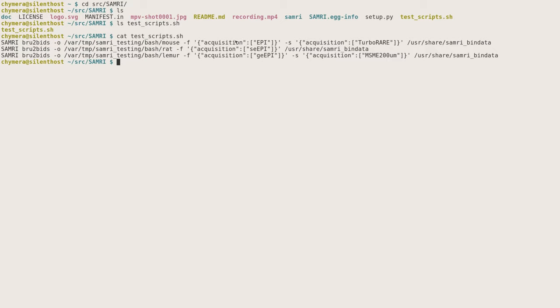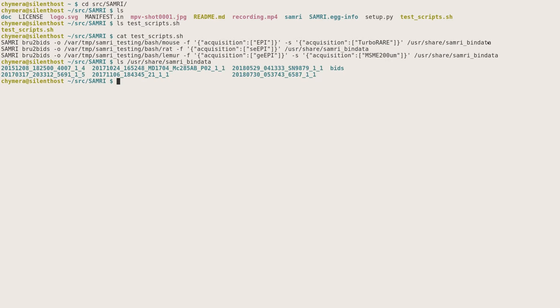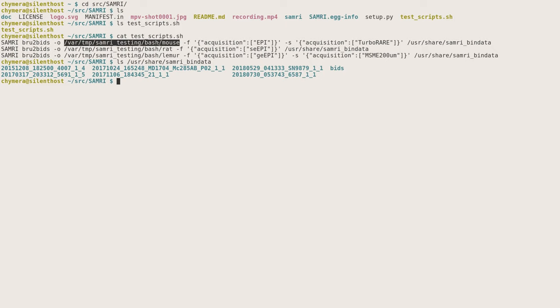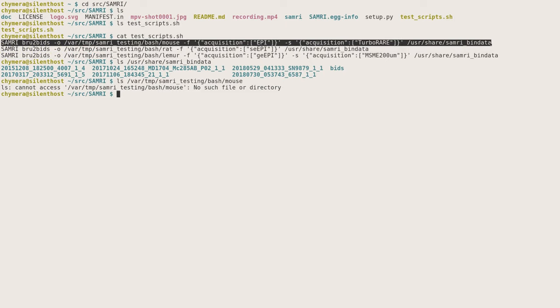"-f" is the selection criterion for the functional scan, "-s" the selection criterion for the structural scan, and the last directory is the directory from which the data is sourced. If you look inside of it, you will notice that there are a bunch of Bruker ParaVision directories inside. If you look at the output directory, you will see that it is currently non-existent.